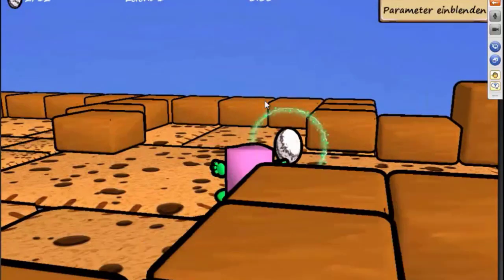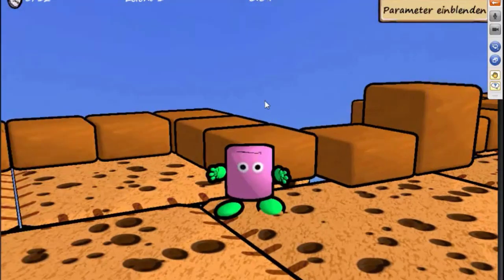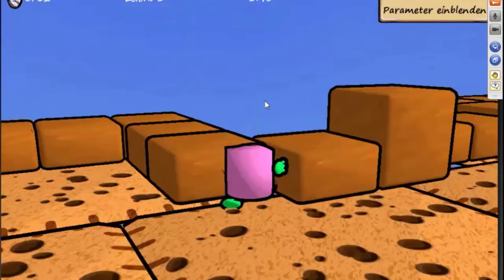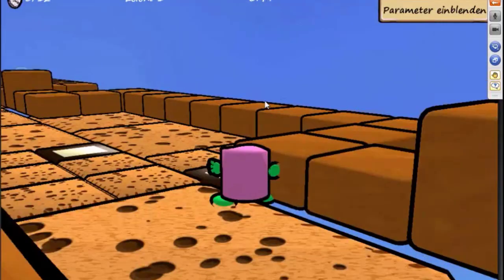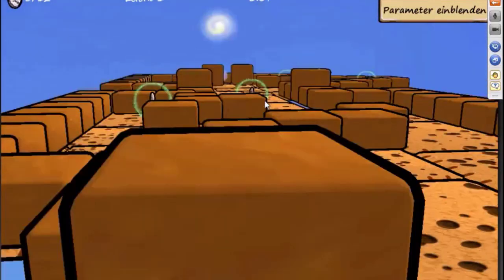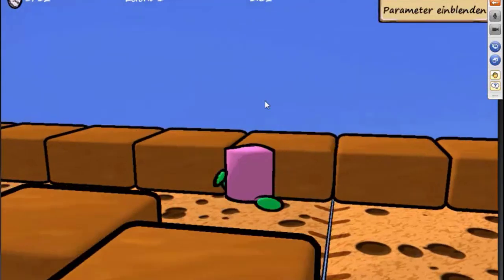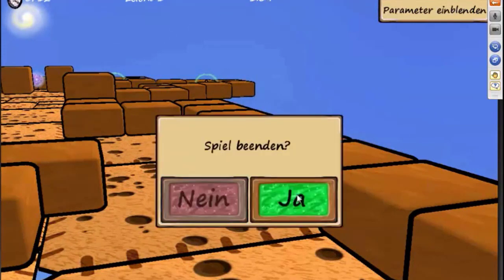On the more complex levels, there are more challenges to be made, different levels of courses, thinner roads, ice-coated underground, and much, much more. So it's actually a lot of fun to play these games and to basically act like a human joystick on the platform by simply controlling the movements of the marshmallow by shifting your own weight and posture. It's important that the client stands straight in the routine and doesn't do this by controlling their hip. So that's basically the scope we have here.